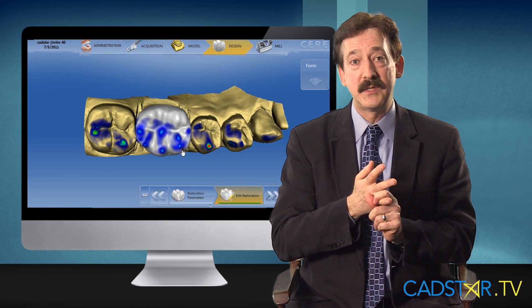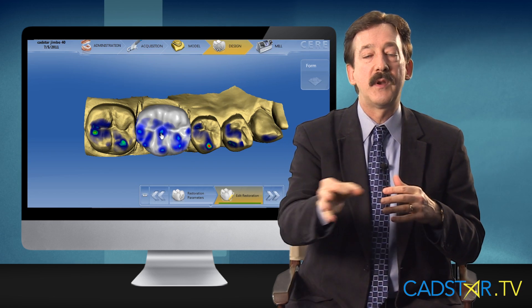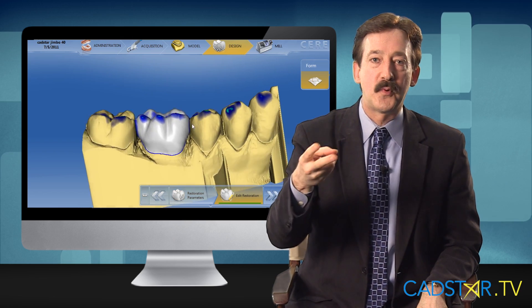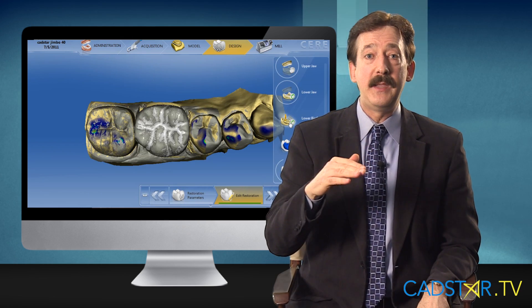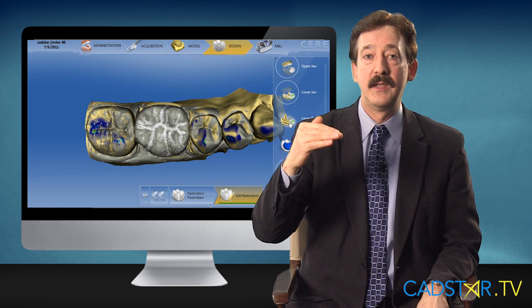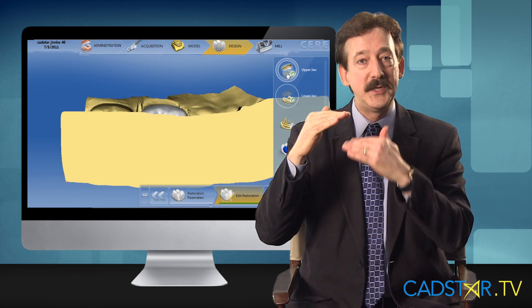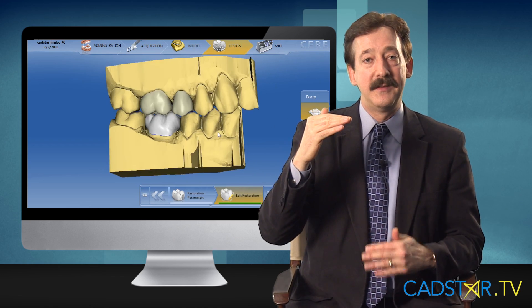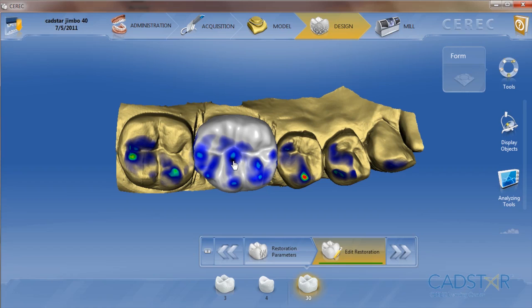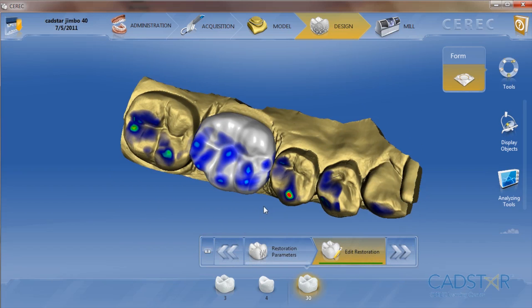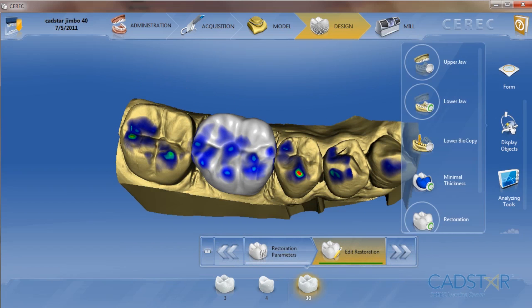So that's three areas: working cusps, marginal ridges, and on molars, landing pads. We have two parameters that affect occlusion. With biocopy, occlusal offset has the main dominance. If you're adding opposing arch — which we do in biogeneric individual — it's both occlusal offset and occlusal contact strength. Those two parameters work together like a marriage; you can't have one without the other, particularly when you want to refine your occlusion.